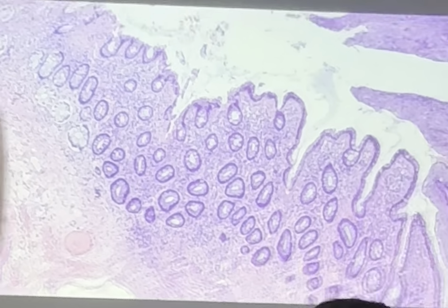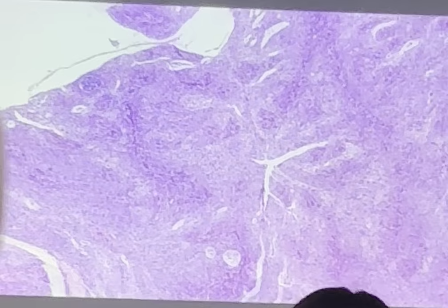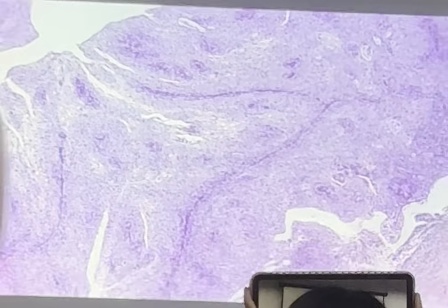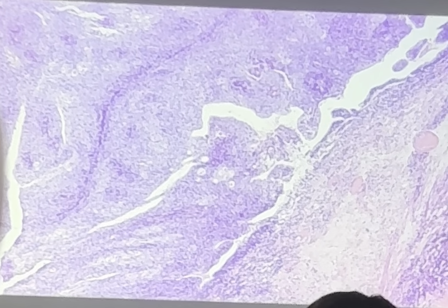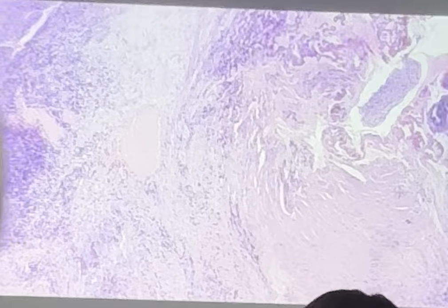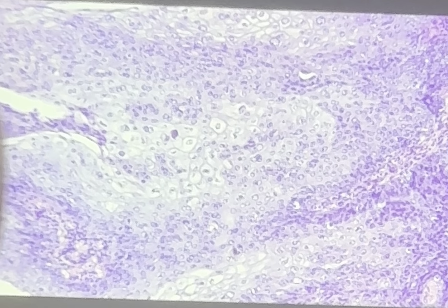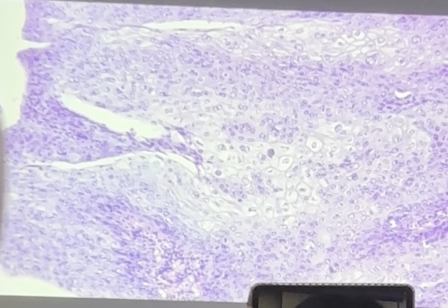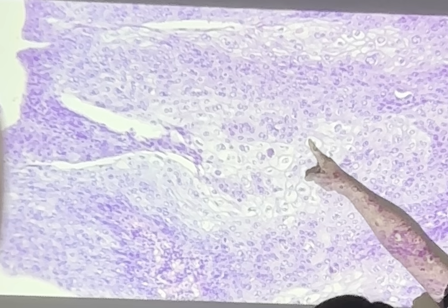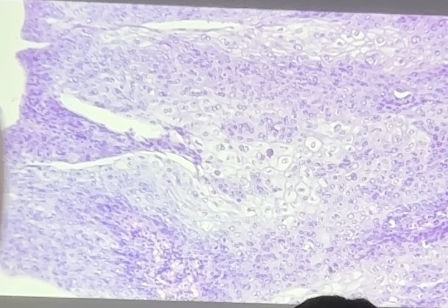But what happened at the skin? This is too much skin. Alright? This is way too much. So grossly, this looked like a cauliflower. It's like a little cauliflower-like mass. And so we see a lot of these squamous cells that are proliferating. And we see, interesting, these relatively large cells here that have somewhat of a halo and a little bit irregular nucleus.